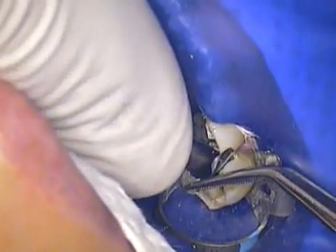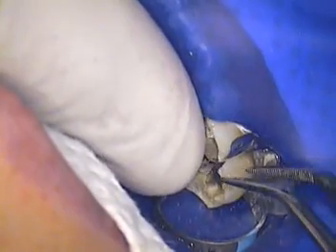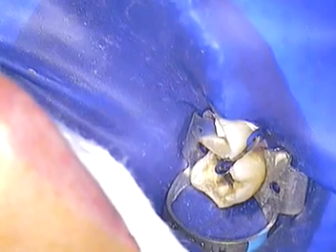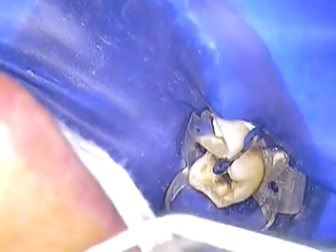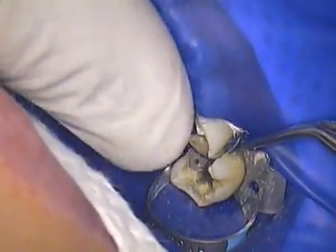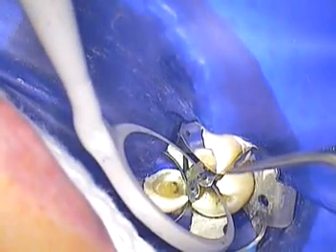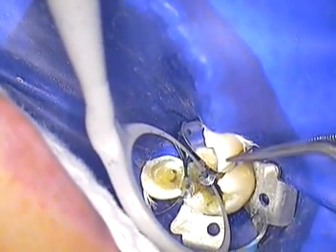Doctors should always be told what to do — that's lesson number one in every office. Always tell your boss what to do and the world gets much better and easier. Now when the patient starts telling your boss what to do, we've really got to work on that. First thing I'm gonna do is put the Composite Tight in, then put the wedge in place.